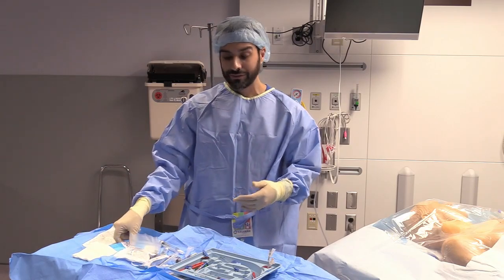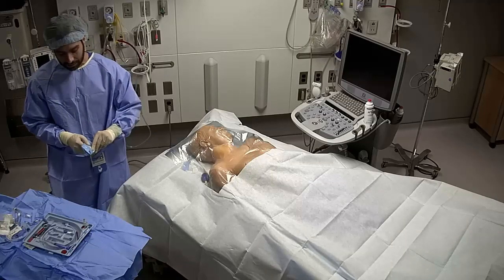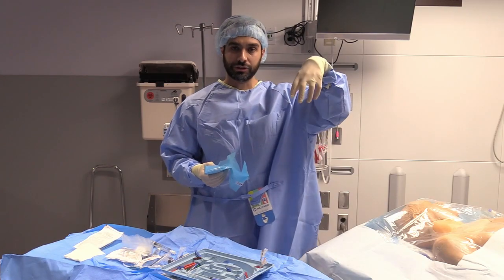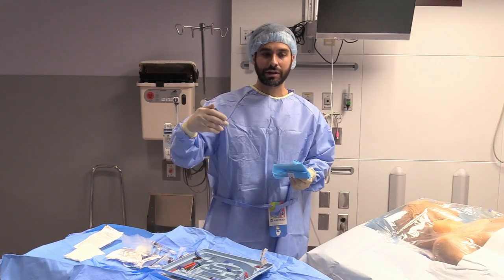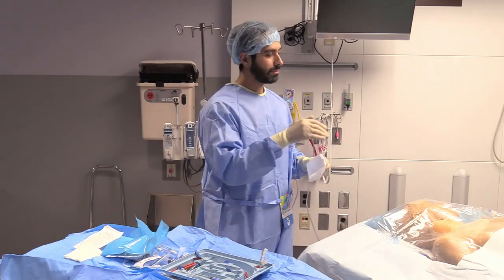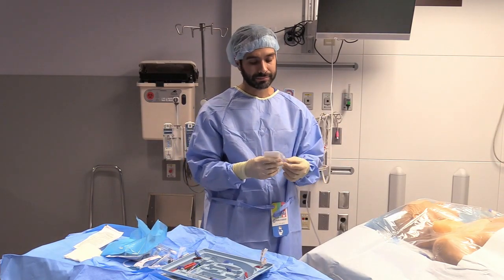So now we've numbed the patient. We've identified our target previously. We've got our ultrasound. We've left jelly on top of the vascular probe on the ultrasound so that when we're ready to go, there's gel there. There has to be an interface. If there's air between the ultrasound and the patient's skin, you won't see anything, or it'll make your images dampen. So it's important to make sure that you have a layer of gel on first. It's just much easier to do it that way.